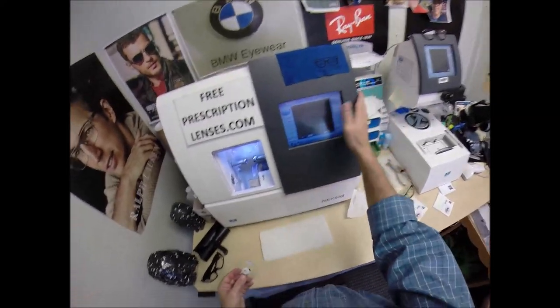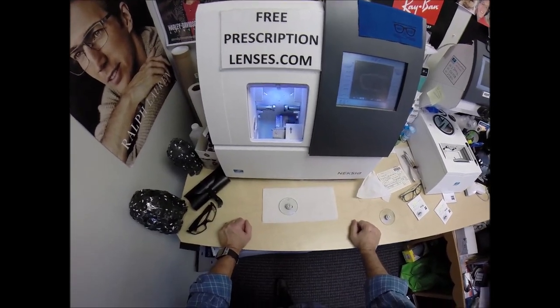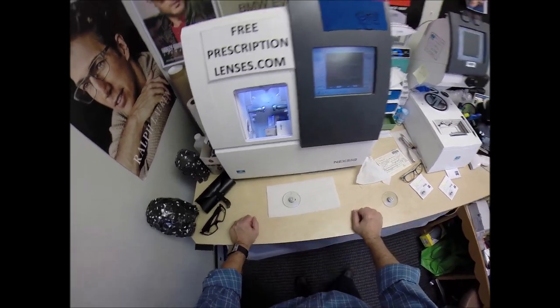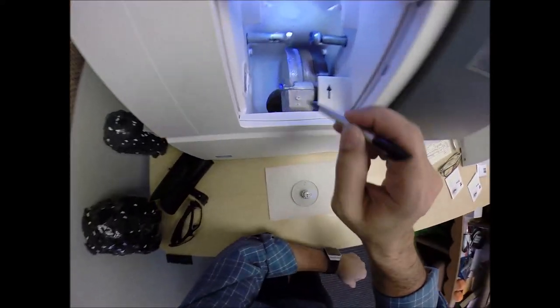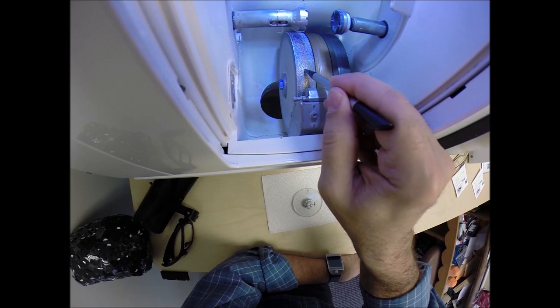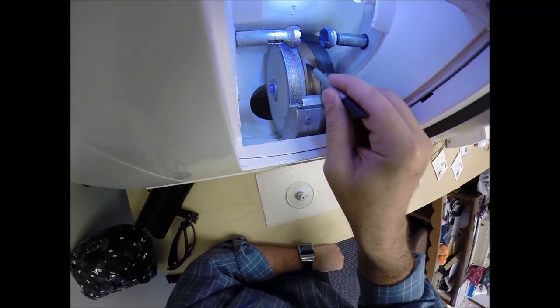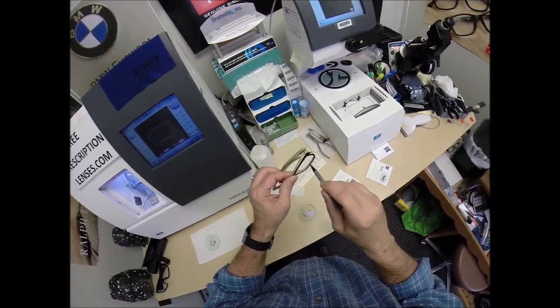This is the edger. This is what costs $40,000 and weighs 200 pounds. The cutting wheel is a diamond-crusted wheel that grinds away your lens material until it's the final size. This wheel in the center puts the V-shaped bevel onto the lens so it stays inside the bevel of the frame.